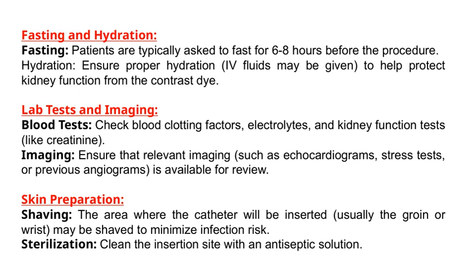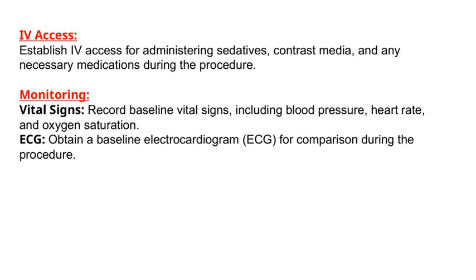They help us minimize risks and provide the best care for you. Let's talk about IV access first. It's crucial to establish an IV line at the beginning of the procedure. This allows us to administer sedatives, contrast media, and any other medications that might be needed along the way. Having reliable IV access ensures we can respond promptly to any changes or needs during the procedure.